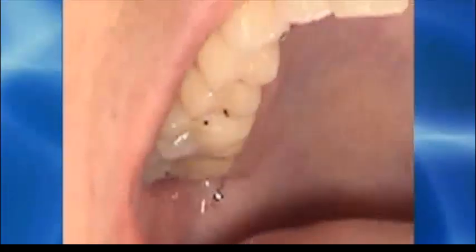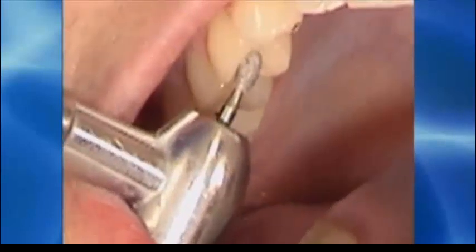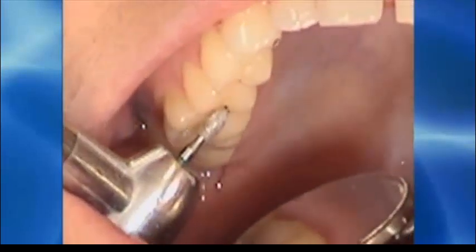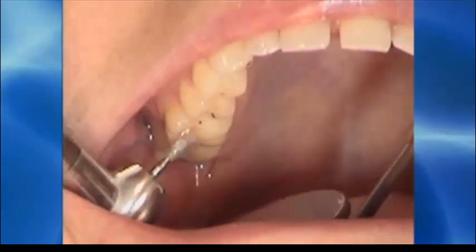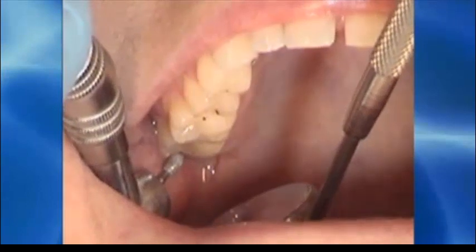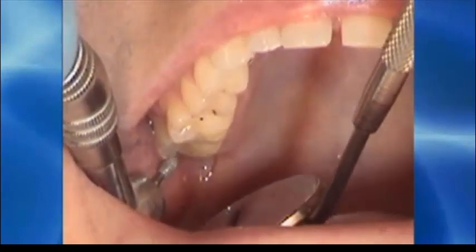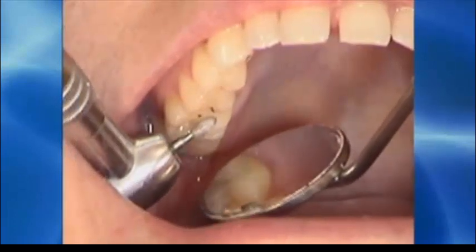Now when we mark the right side in the right excursion, we're looking at the mesial aspect of the first premolar. There's some friction and drag, and you can see this linear mark on the palatal aspect of the second premolar. That definitely demonstrates long disclusion. And then back here towards the buccal aspect of the second molar, heading towards the buccal cusp, that's where the long disclusion is present.